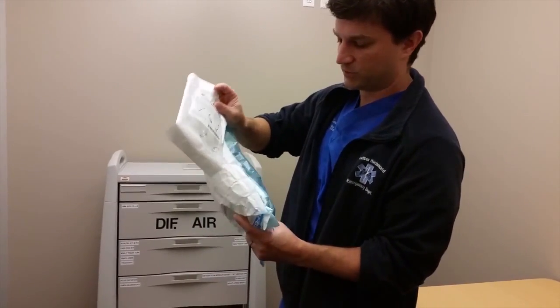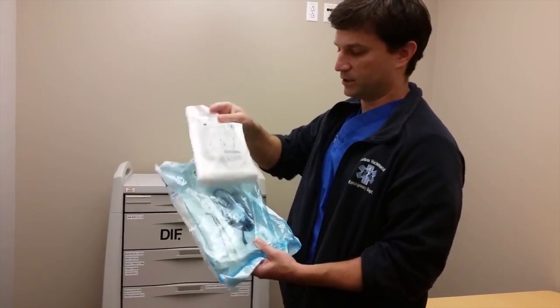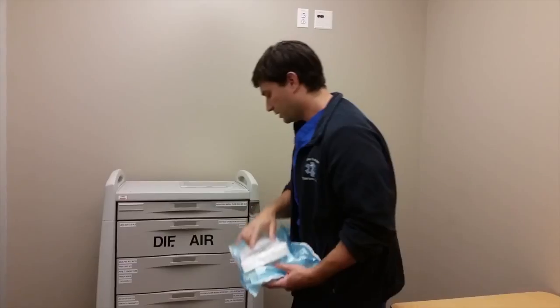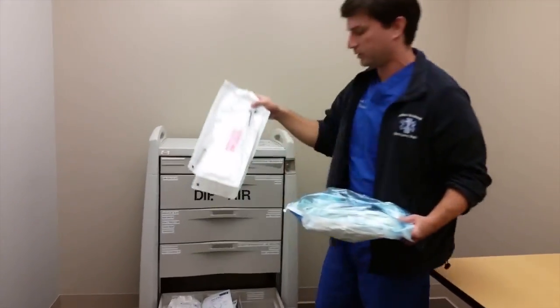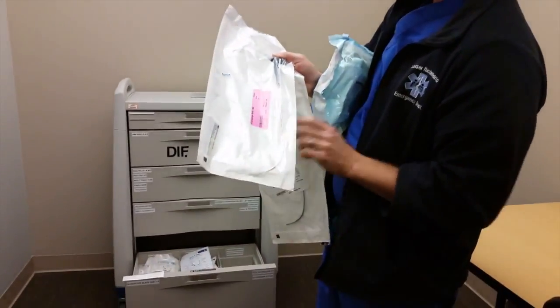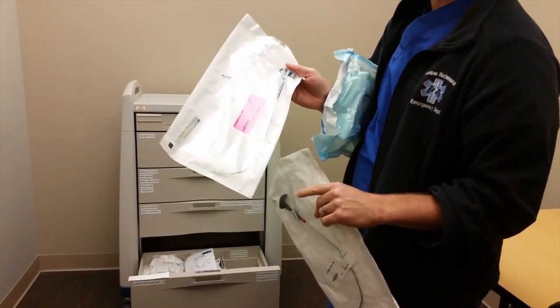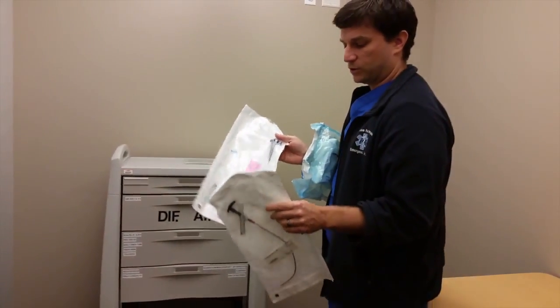They also have a special stylet in here because the other thing you need to know about glide scopes is that because of their strange acute curvature, they need a special curve to the stylet, so they have some prefabricated ones that go along with them. All the pediatric ones are contained in here. The adult ones are a la carte on the side here, and you can see how sharp that curve is all the way down. If you're doing a glide scope approach, you have to make sure that you get the stylets out too. It's not your traditional stylet. You will never be able to get the tube in otherwise, just because of the strange curve it is.